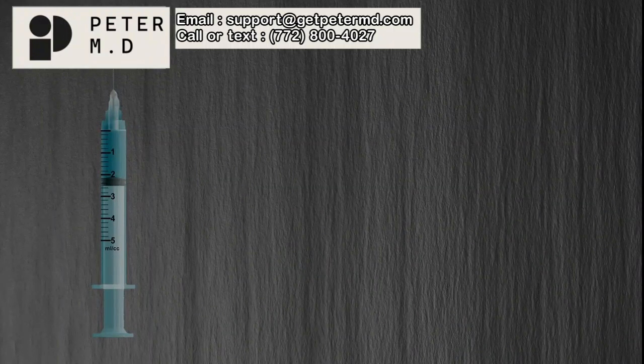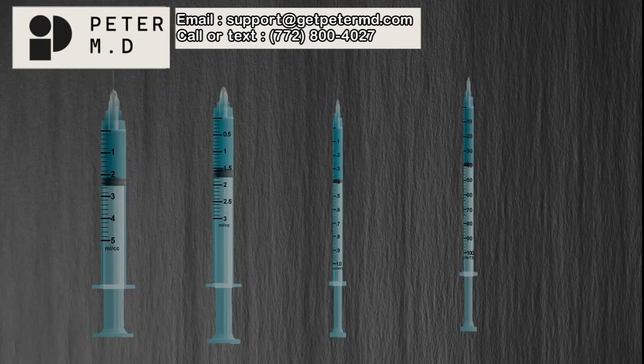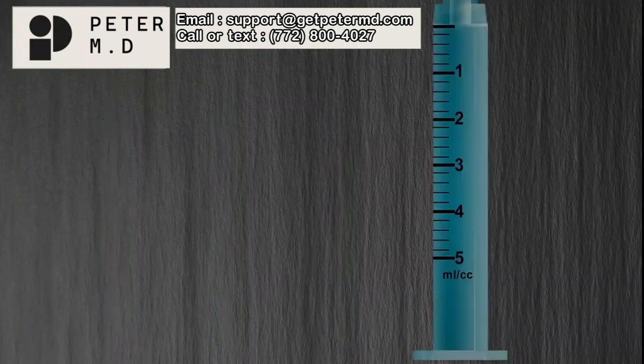We will cover the graduation marks on 5 milliliter, 3 milliliter, 1 milliliter, and U100 syringes. There are many other sizes of syringes, but once you finish this lesson, you will feel confident in reading syringes of any size.